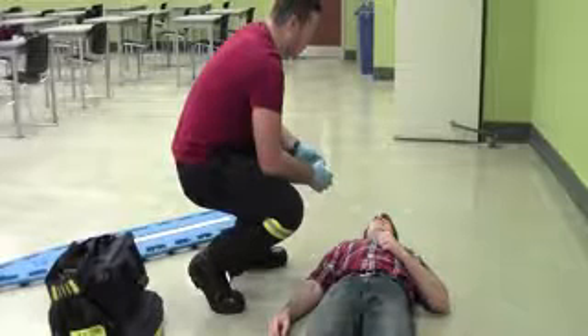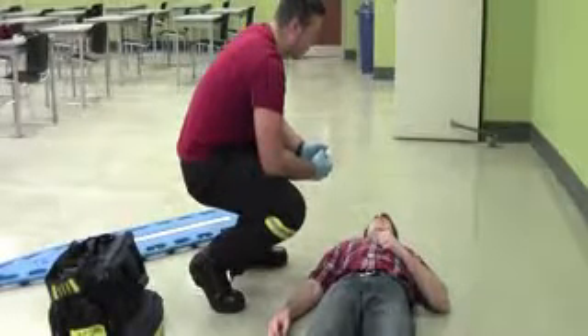Hi, sir. I'm going to get you not to move. My name is Daniel, I'm a student paramedic. Are you okay for me to help you out today? Yeah. Awesome.